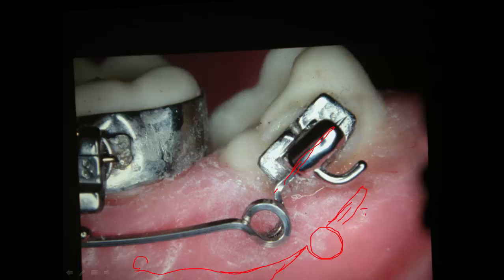There may be cases where you want the hook down. It's kind of unusual. You most always will put the hook up like that, and we make one or two circles and it's not too important. It just makes it a lot gentler to activate one. It's got a couple of circles in it.